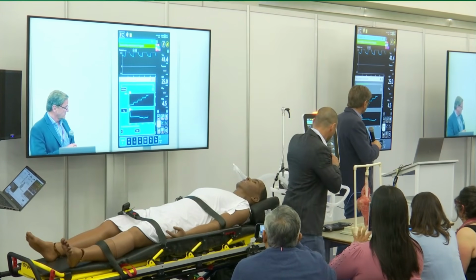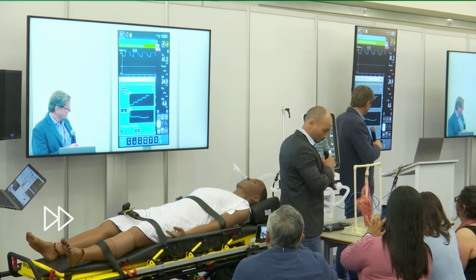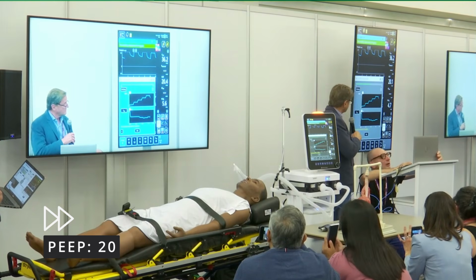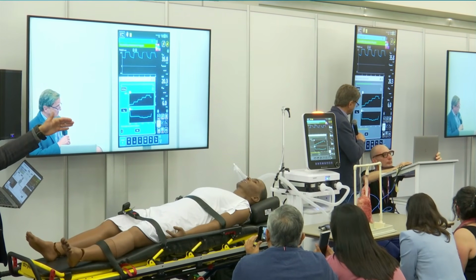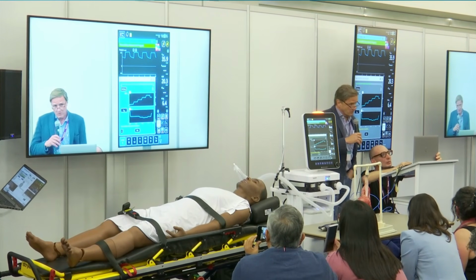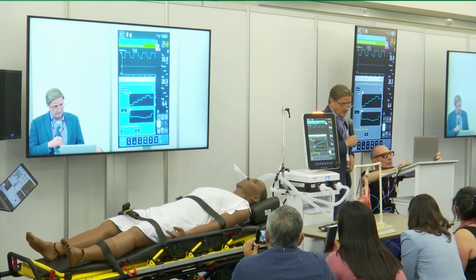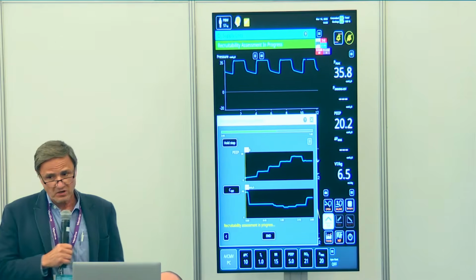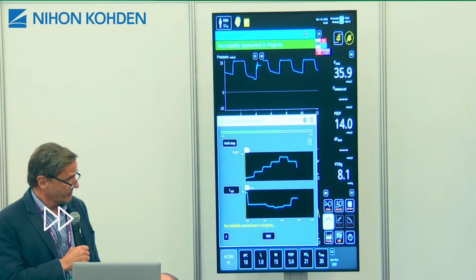If you come in here, we can check. Here, on the settings. You go all the way up, and now you're going all the way down. Okay. You are going to understand why we do incremental and decremental. It's very essential. Because it's the only way that we have some quantitative measurement. Okay.